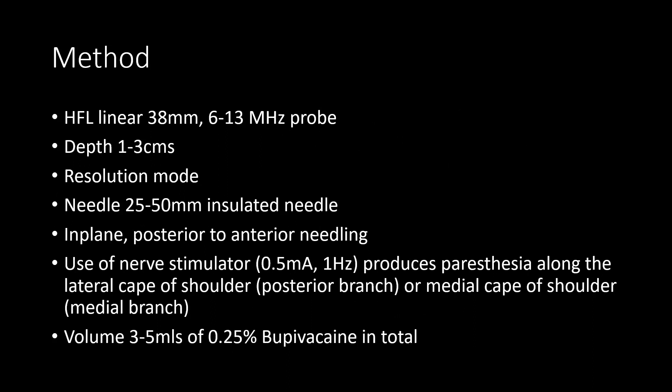The technique is similar to an interscalene brachial plexus block. Scanning is performed with a high frequency linear probe at 6 to 13 megahertz, with a depth setting of 1 to 3 centimeters in resolution mode. The neck is scanned at the level of C6 to identify the C5, C6, and C7 nerve roots, then scanning is continued cephalad to the level of C4. A 25 to 50 millimeter insulated needle is inserted from posterior to anterior, and a typical volume of 3 to 5 mls of 0.25% bupivacaine is used. If a nerve stimulator is used, paresthesia can be elicited in the lateral or medial cape of the shoulder, depending on which branch of the supraclavicular nerve is in contact.